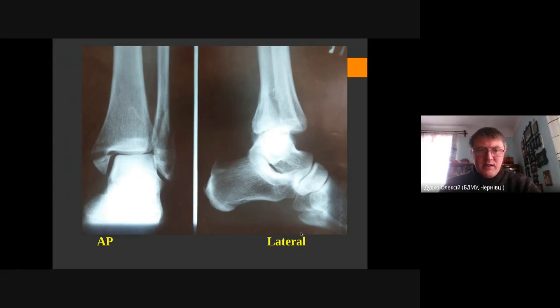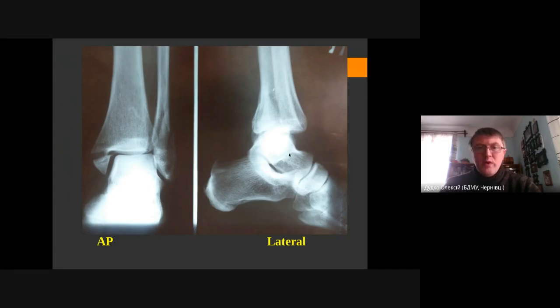We have displacement here, so we have a displaced posterior edge fracture with subluxation of the foot to the posterior side. To summarize: we have a trimalleolar fracture — medial malleolus, lateral malleolus, and posterior edge of the tibia — with subluxation of the foot to the lateral side and to the posterior side. That is your diagnosis.